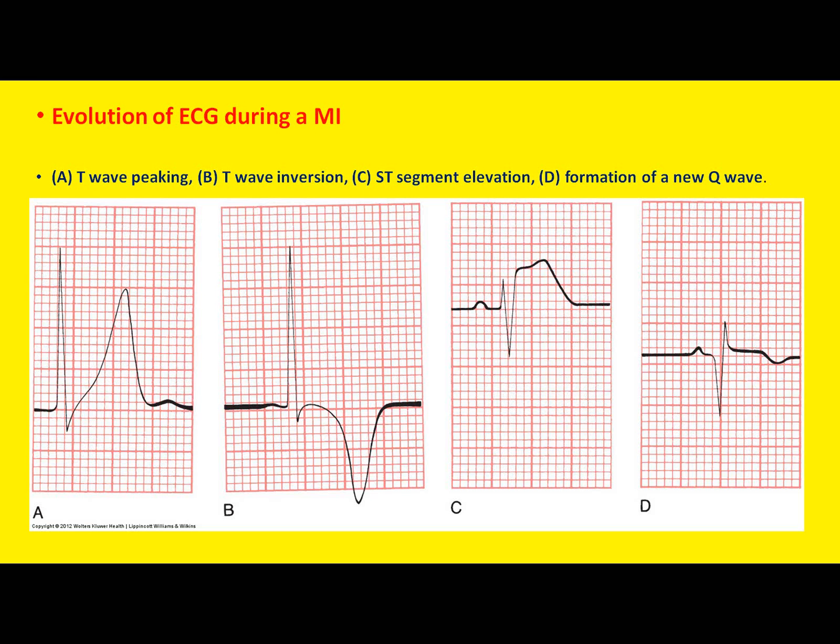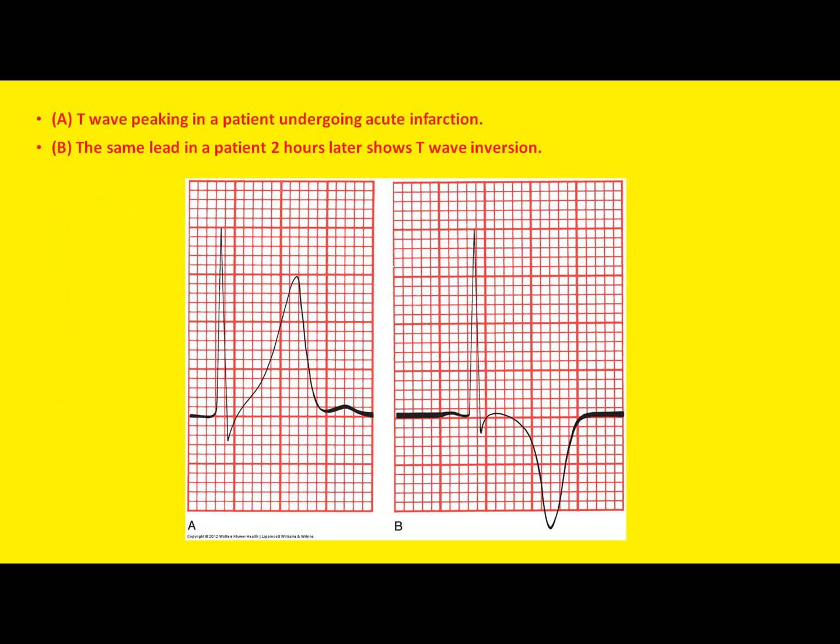But this is definitely longer than the R part, isn't it? So that means the heart attack has completed now. Now there's permanent damage to the heart. Q wave can mean permanent damage to the heart. That's happened.